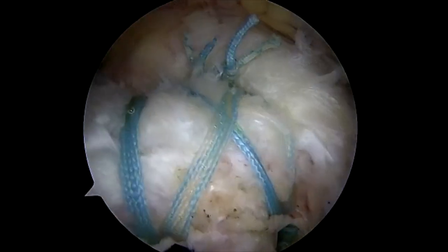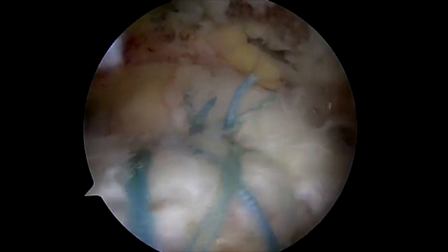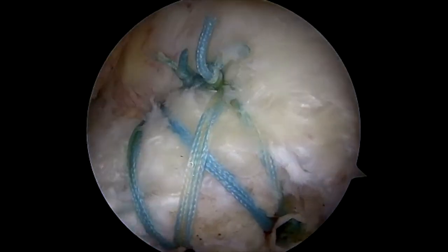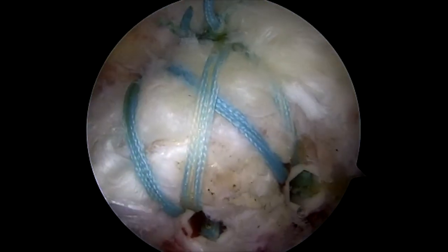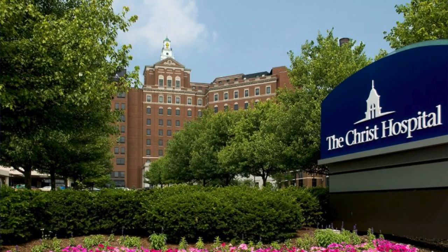Once inserted, the inserter is removed and the tapes are cut. A final view demonstrates that the supraspinatus tendon is nicely re-approximated and there is no evidence of subacromial impingement. Thank you.